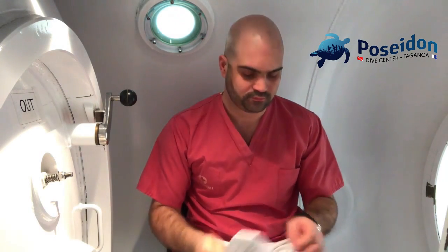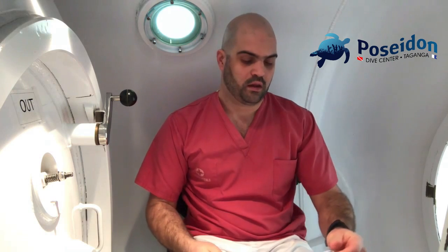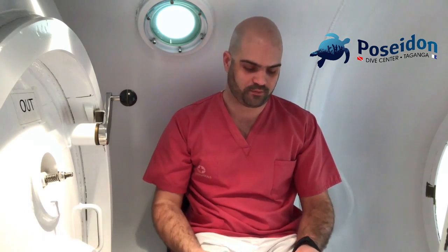So, are you okay? No, I'm not okay. I have a problem in my ear. Okay, so this is the signal for ear problem, for sinus problem, and for lung problem. Alright? Then we have this signal that means I have a problem with the breathing, or I have no air in the line. That means that the outside operator must check all the valves and that everything is okay and working properly. So this sign means no air, or problem with the line of the air or gas supply.